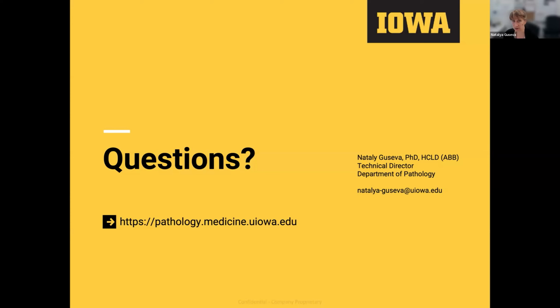This is an interesting question. So we started with DNA sequencing on different approaches. We started with point mutations and expanded to panels. We have multiple approaches for how we do it in the lab. So for us, most important was fusions. We do run the same sample in parallel. We extract it as TNA. We use RNA for Archer analysis, and DNA we sequence with different platforms.